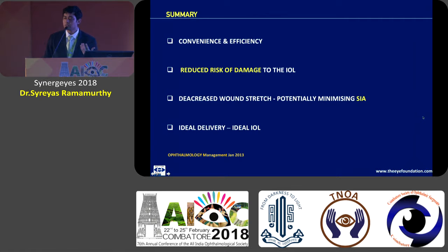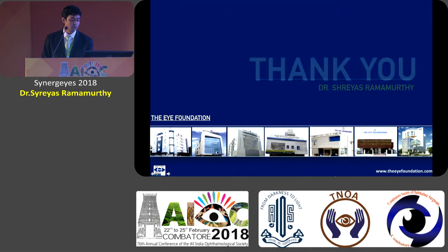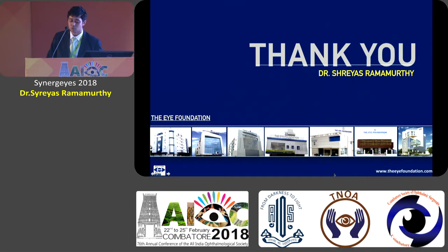So to summarize, the preloaded IOL system definitely enhances the convenience and efficiency that you have in the OR, and greatly reduces the risk of damage to the IOL, which I think is invaluable to us. When you're doing a premium case with a premium IOL, you definitely don't want broken haptics. It definitely decreases wound stretch, potentially minimizing the SIA, and is an ideal delivery system for delivering the ideal IOL.